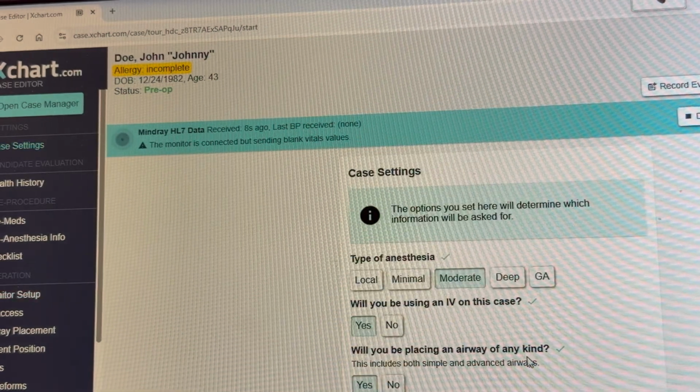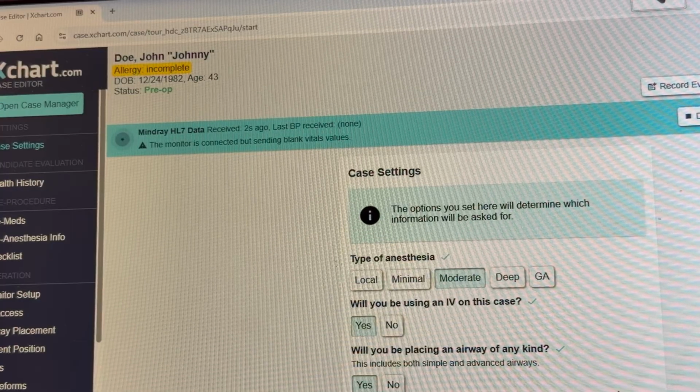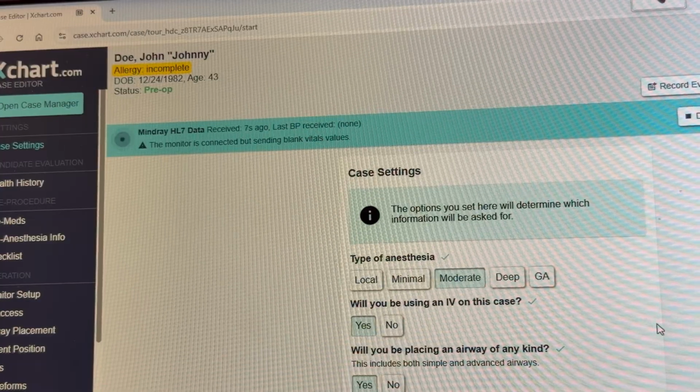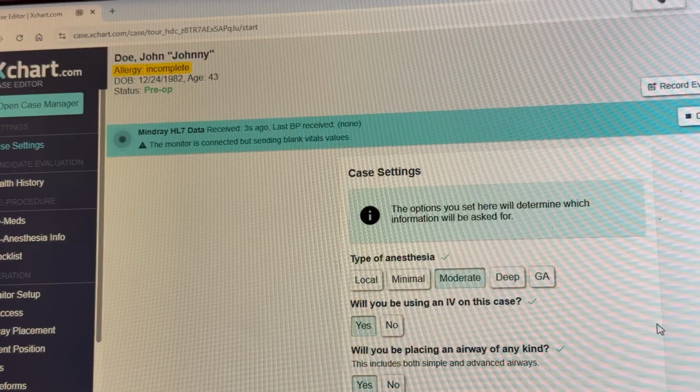I did want you to know that that's how we set this up. This is exactly the process that I use every time. It's very easy. Once you do the process, you know that you do have to wake up the monitor, and you do have to plug it into a C port within the computer.